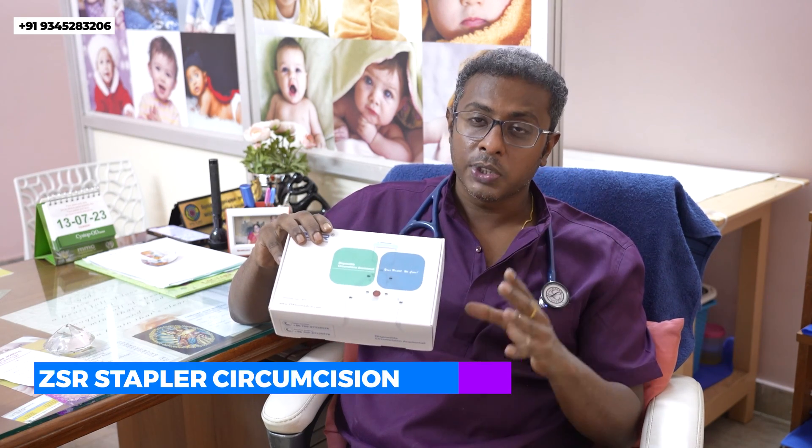Hi, I'm Dr. M. Jo Kaushik, andrologist practicing at Caroline John Hospital, Nagarpur. Today we are going to introduce a new technology in circumcision, which is the ZSR circumcision. This is the ZSR stapler, which is the most advanced form of circumcision device.